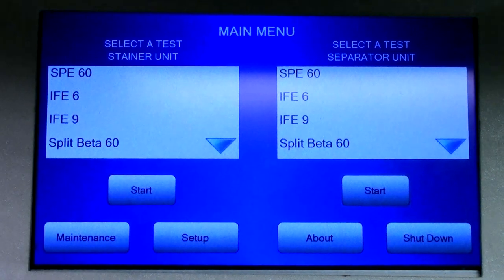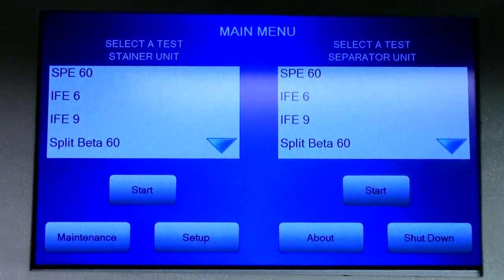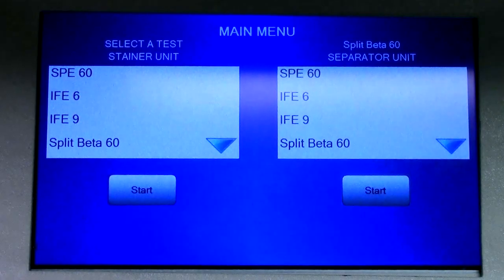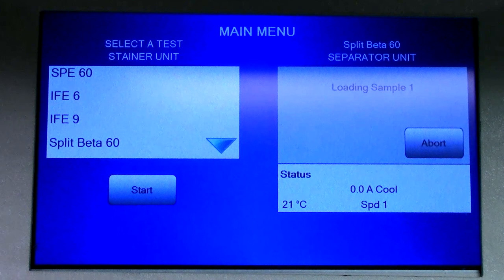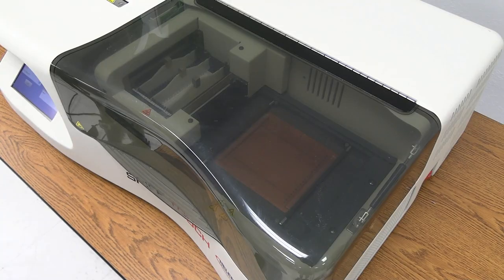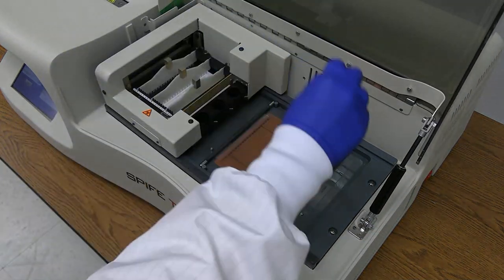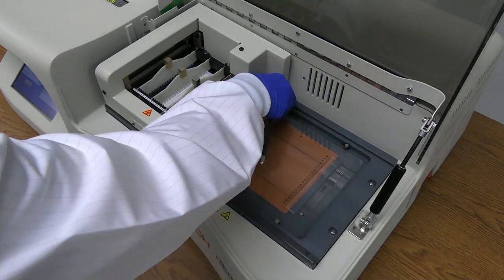Now it is time to begin the test. Use the arrows under separator unit to select the appropriate test and press start, then press start again. The SPIFE Touch will apply the samples, electrophorese, and beep when completed. After electrophoresis is complete, open the chamber lid and use the gel block remover to remove the gel blocks.